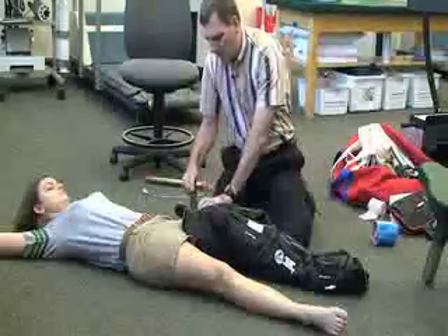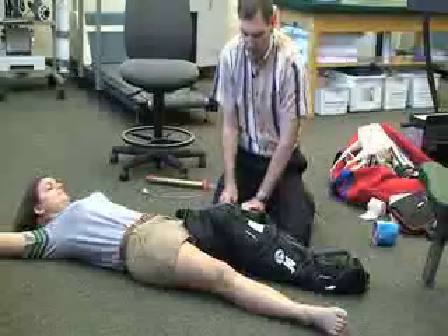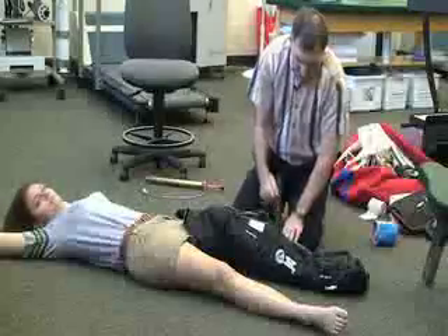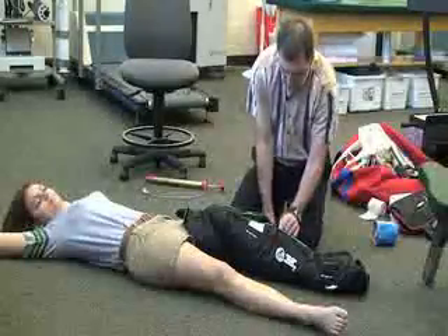Before you take the air out, just want to make sure that these are fastened as tightly as possible without injuring her.